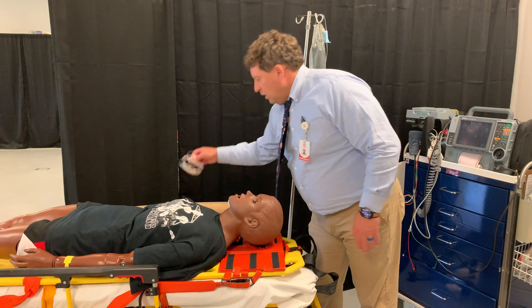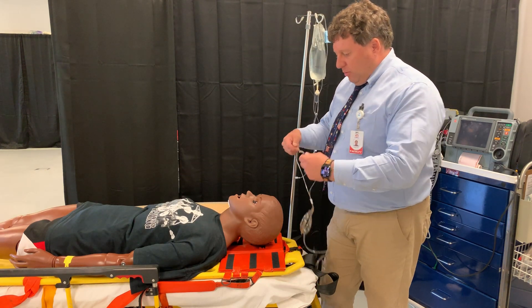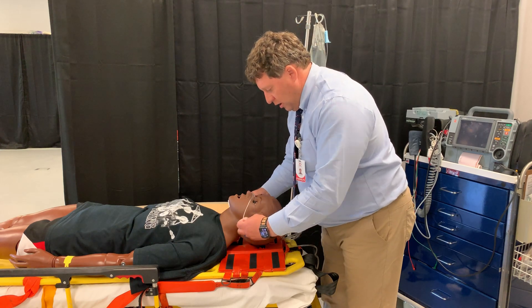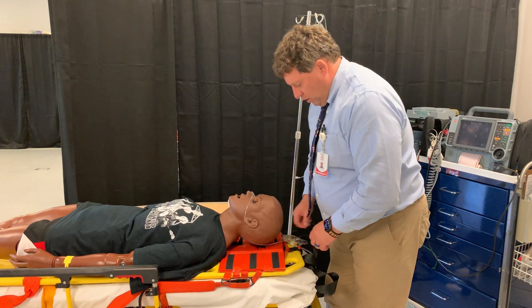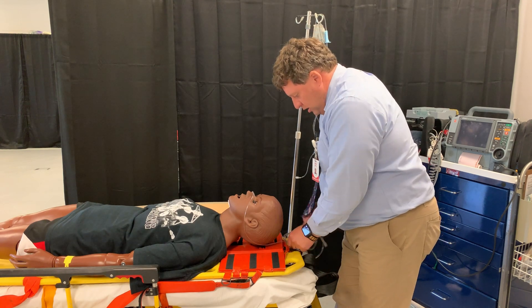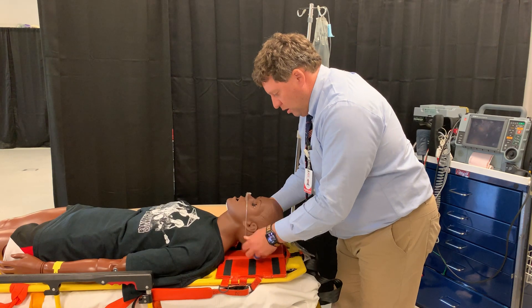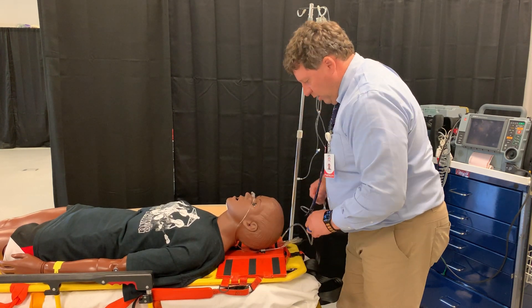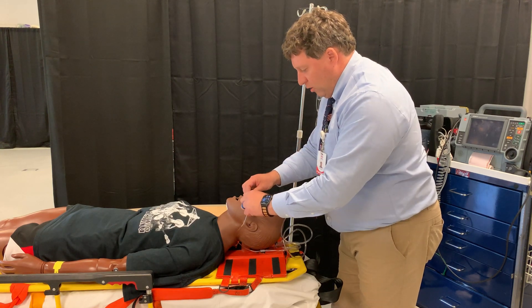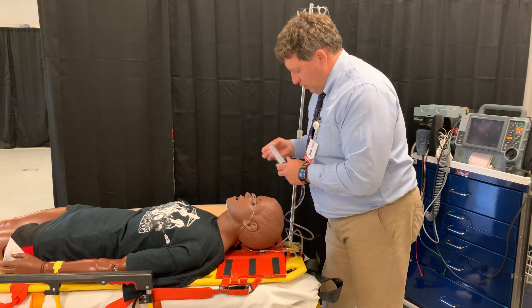If I take the prongs of the nasal cannula and place them on the bridge of the nose — you can either run it behind the ears or behind the head, whichever — I can flush down the tubing and it will continue to flush from the middle of the face outward, which is what we're supposed to do when we flush an eye.